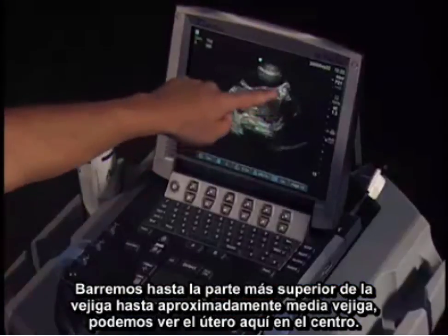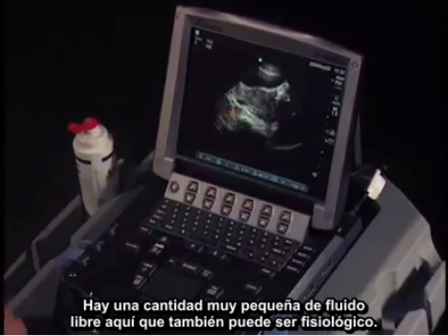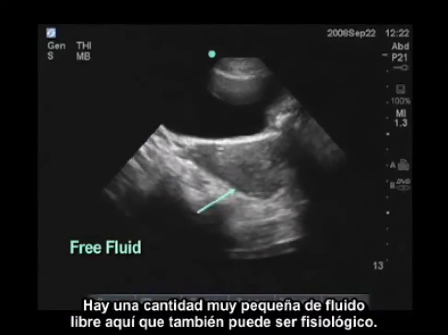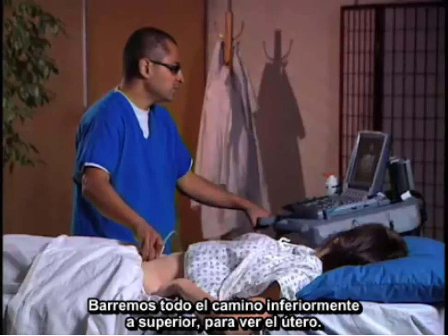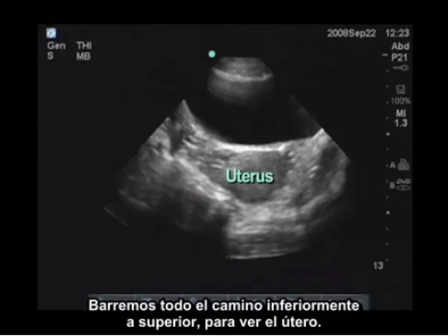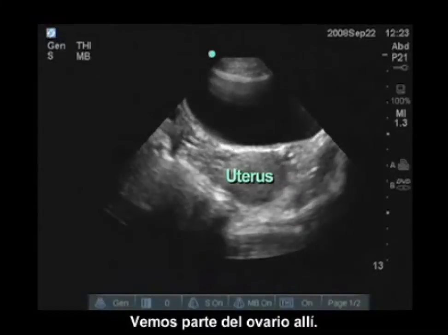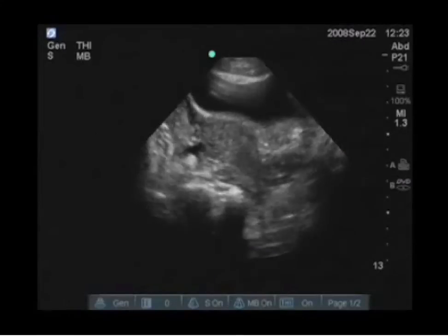We can see the uterus here in the center. A very small amount of free fluid here, which can be physiological as well. So we're scanning all the way inferiorly. To more superiorly, we see the uterus. We actually see part of the ovary there. And then we're going to go all the way more superiorly.